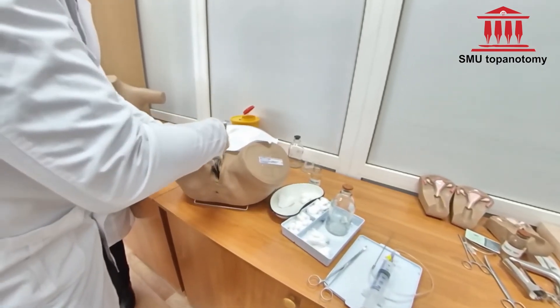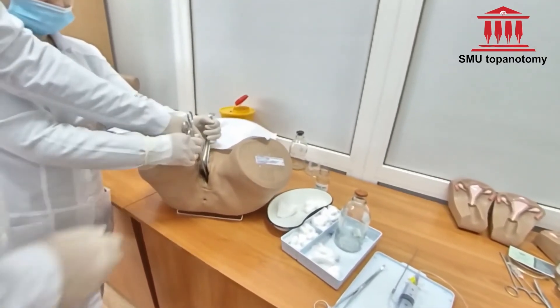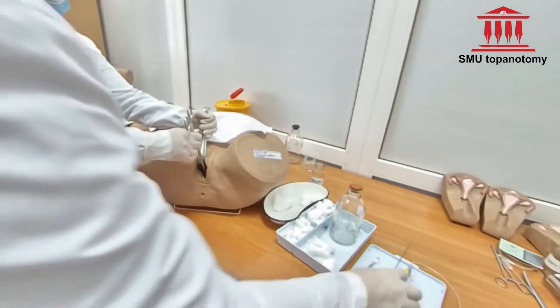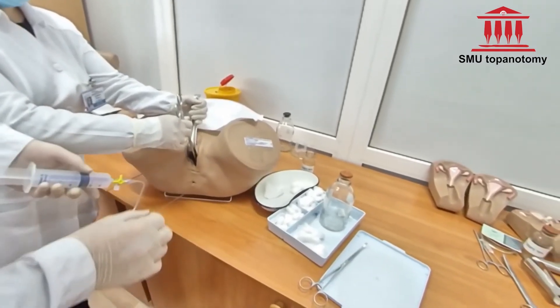Under the cervix, strictly on the midline, 1 cm away from the transition from the posterior to vaginal part of the cervix, insert the needle through the fornix 2–3 cm deep.